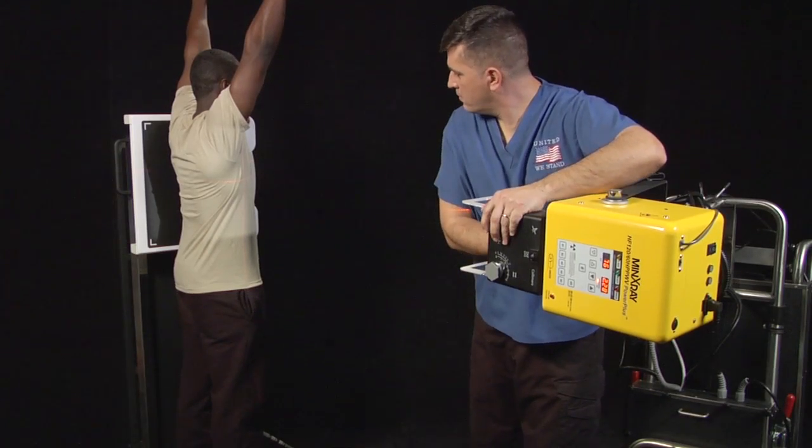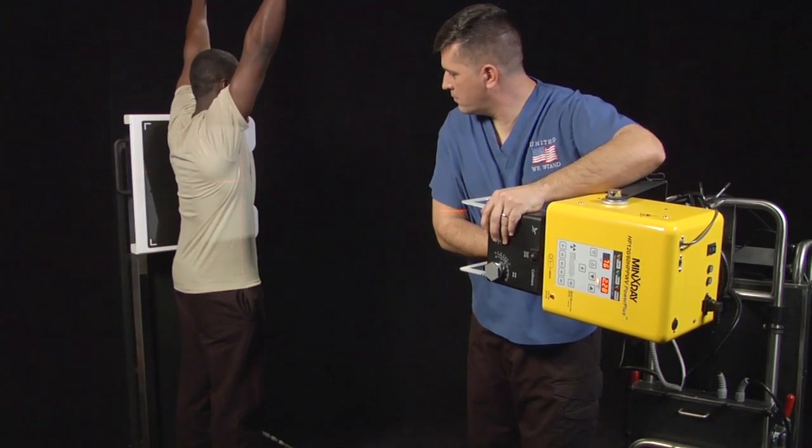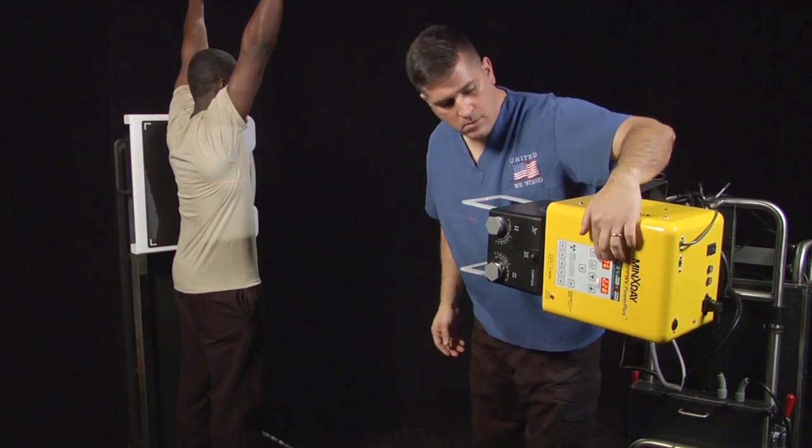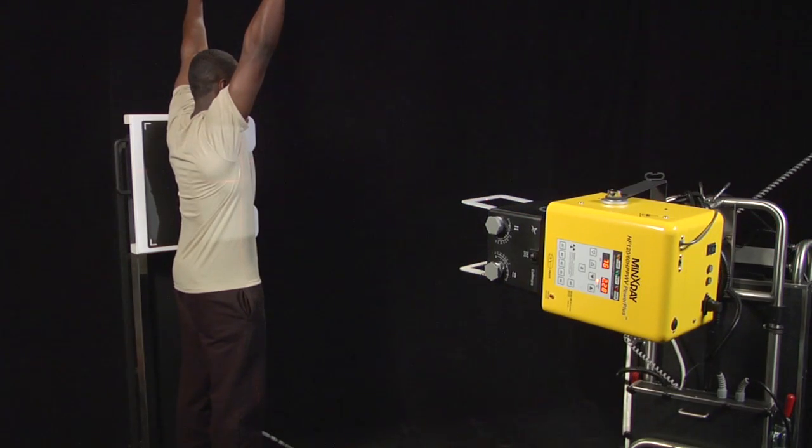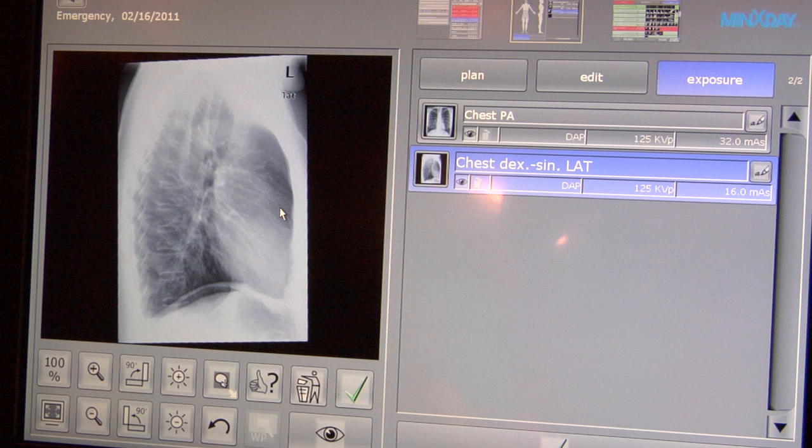Have the patient take a deep breath and hold it. Make the exposure when the green light on the bottom left of the exposure screen is on by pressing and holding the exposure switch until an audible beep is heard or transmitting as seen on the screen. Once the image is on the screen, select the green check mark under the image, then select chest apices study.